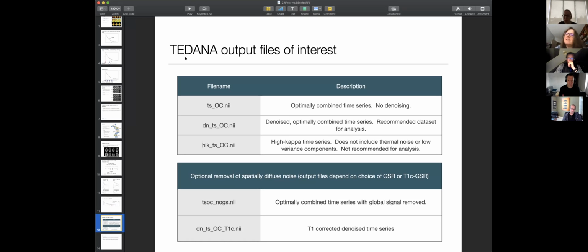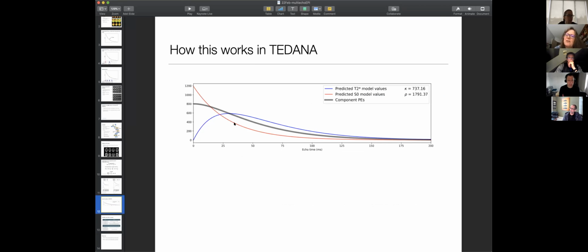So Suzanne, you're saying it regresses it out, so if you have a voxel that's a combination of signal and noise, and more noise, you don't throw that out completely, you still just try to clean it up, is that right? So at a certain point it will throw out stuff, because I believe there is a cutoff in terms of these kappa and rho scores. But the Tedana documentation isn't super complete in terms of all of the interior decision making that it's doing in that ICA.